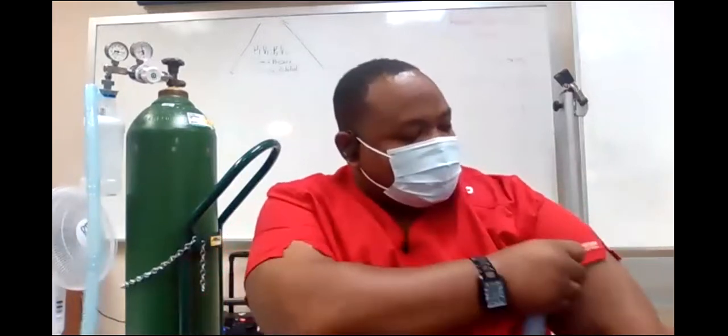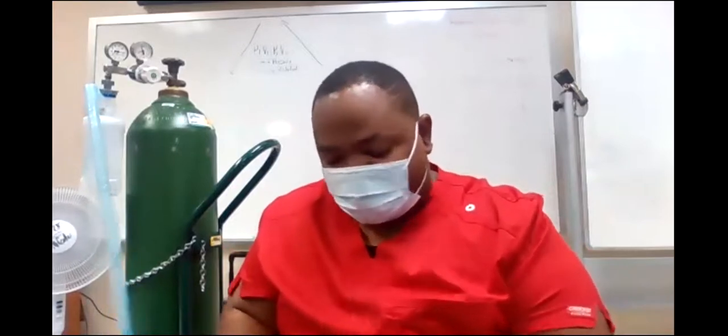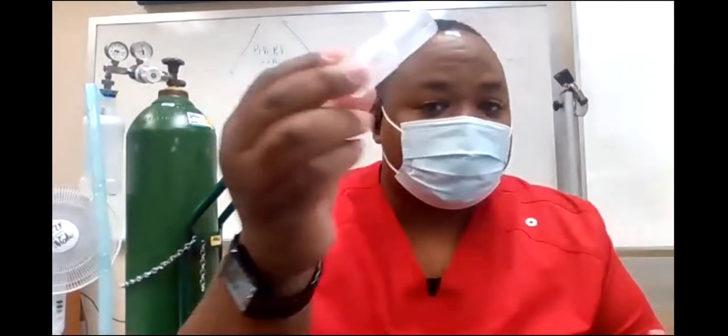If you think back to the non-rebreather mask, if he takes a breath in and that bag deflates or collapses, you need to increase the what? The flow, okay? So that's the only little trick about the T-piece that you need to remember. This little T-piece, we always say T-piece, but this is known as a Briggs Adapter. And the Briggs Adapter must be on the end. He must watch for the flow.